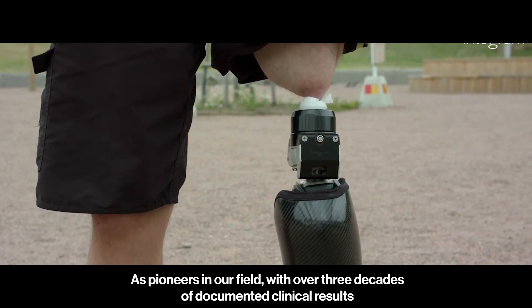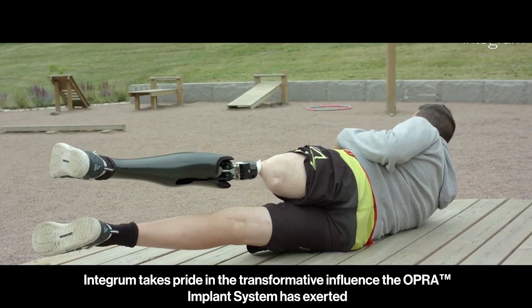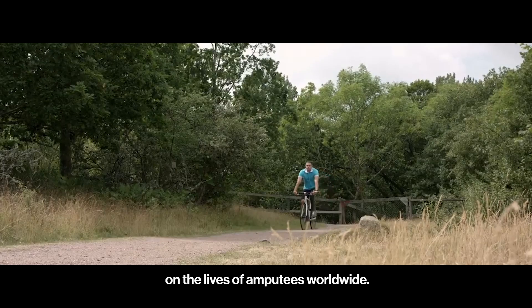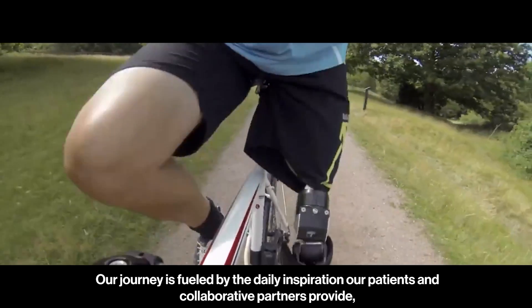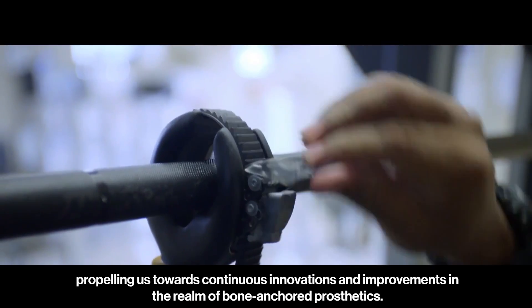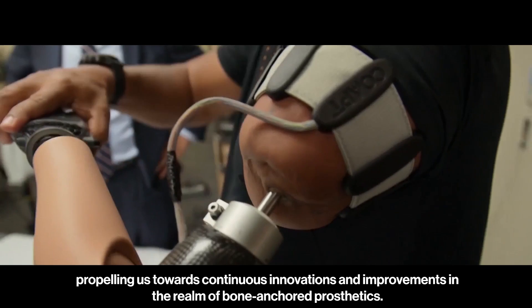As pioneers in our field with over three decades of documented clinical results, Integrum takes pride in the transformative influence the OPRA implant system has exerted on the lives of amputees worldwide. Our journey is fueled by the daily inspiration our patients and collaborative partners provide, propelling us towards continuous innovations and improvements in the realm of bone-anchored prosthetics.